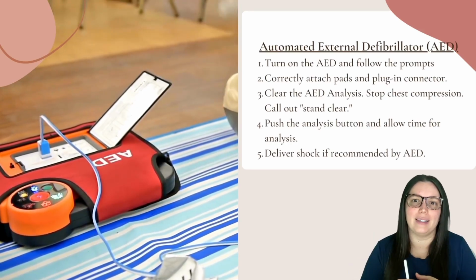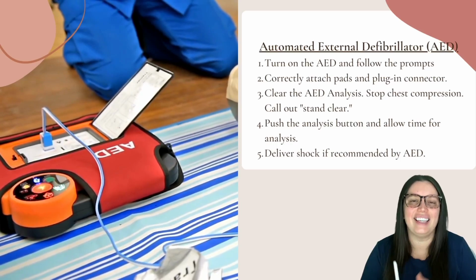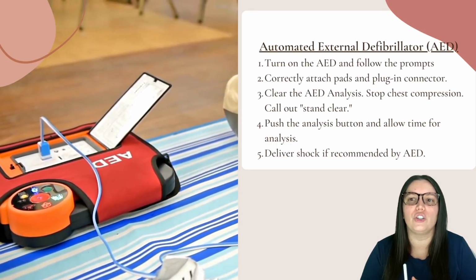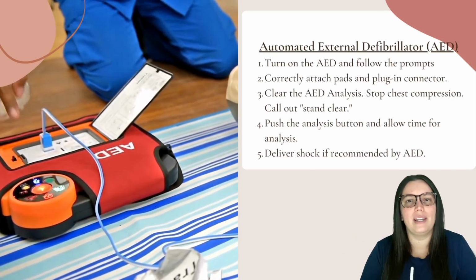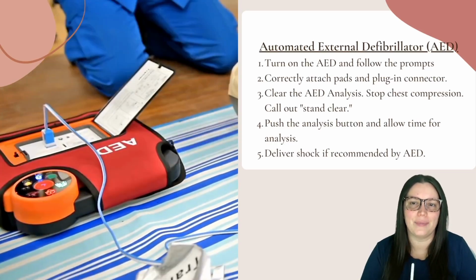Number 3, you want to clear the patient so that the AED can analyze the heart rhythm. You're going to stop chest compressions and you're going to call out, "Stand clear." Once everybody is clear, you want to push the button and allow time for the analysis.